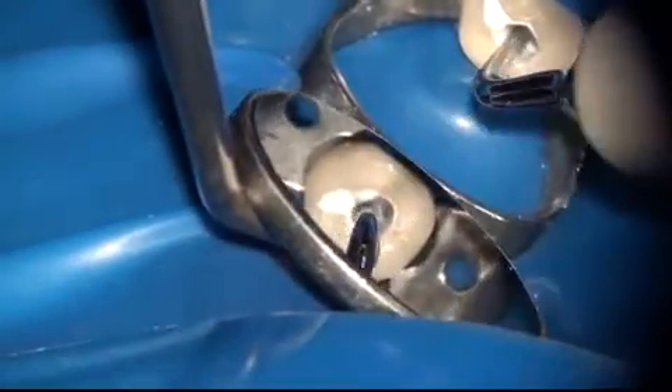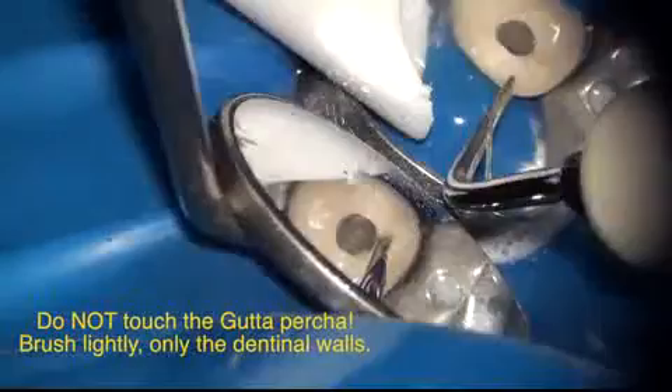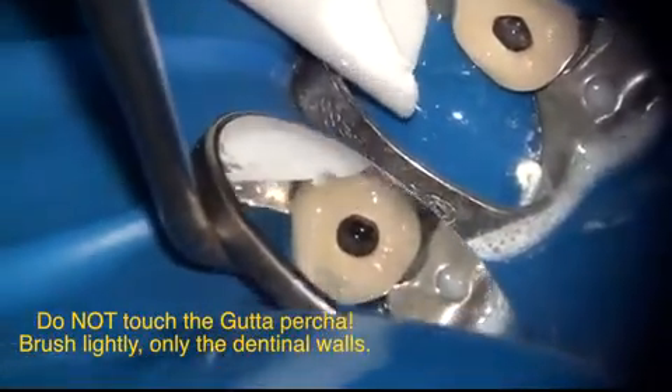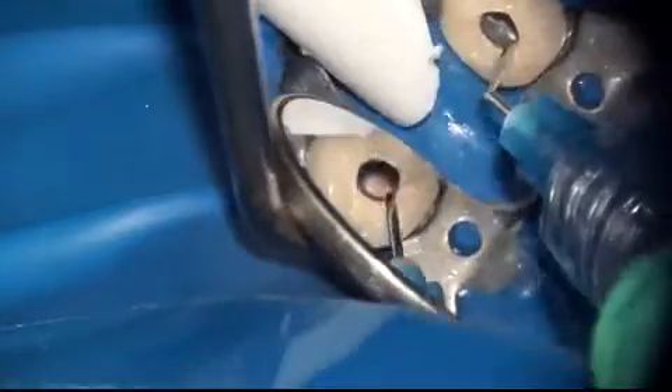It's important not to place too much pressure on the dentinal walls. The goal is to condense the gutta-percha down to get a denser fill. Towards the end, walk your condenser 360 degrees around the perimeter of the molten gutta-percha to get close adaptation to the canal wall. The ultrasonic is then used with a size E14D tip, and as you can see, within 10 seconds all of the sealer is removed from the canal walls. Walking the condenser along the sidewalls also ensures that none of the sealer is washed out from the sides where the seal is present.